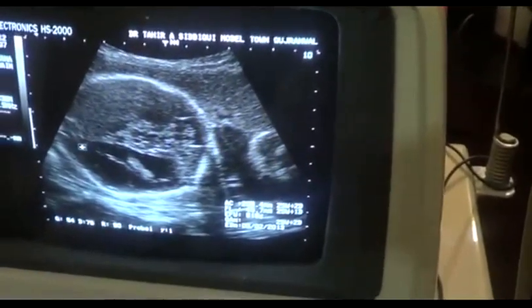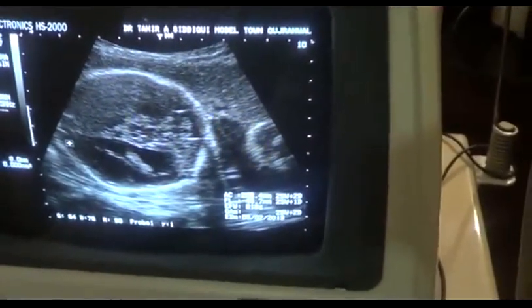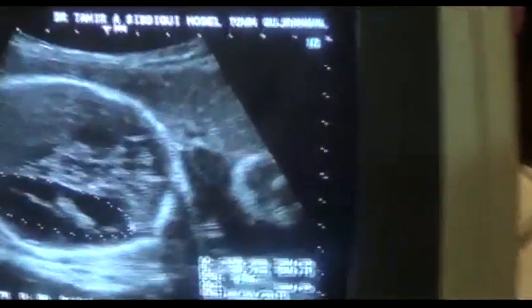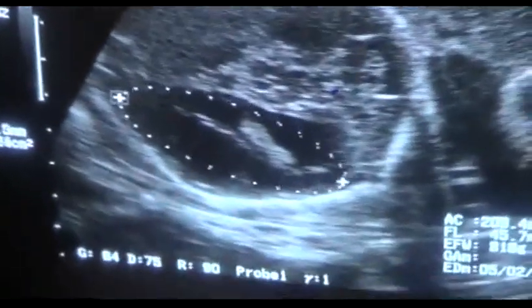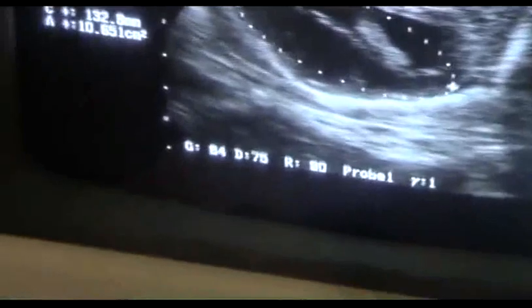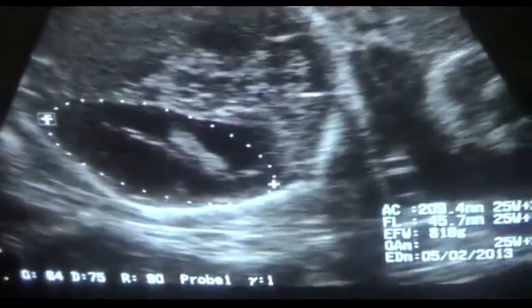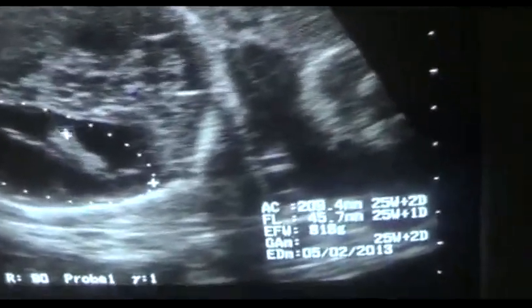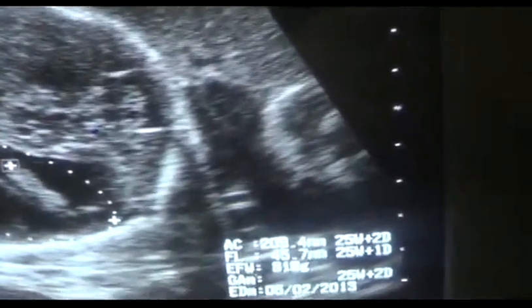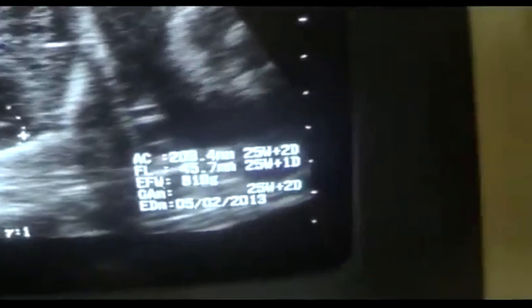See, again, let me mark it for you. Lateral ventricle, dilated. Concentrate on this area of the brain. Roughly, this is the dilated ventricle, and this is the choroid plexus, this echogenic linear area, and its angle is more than 75 degrees.